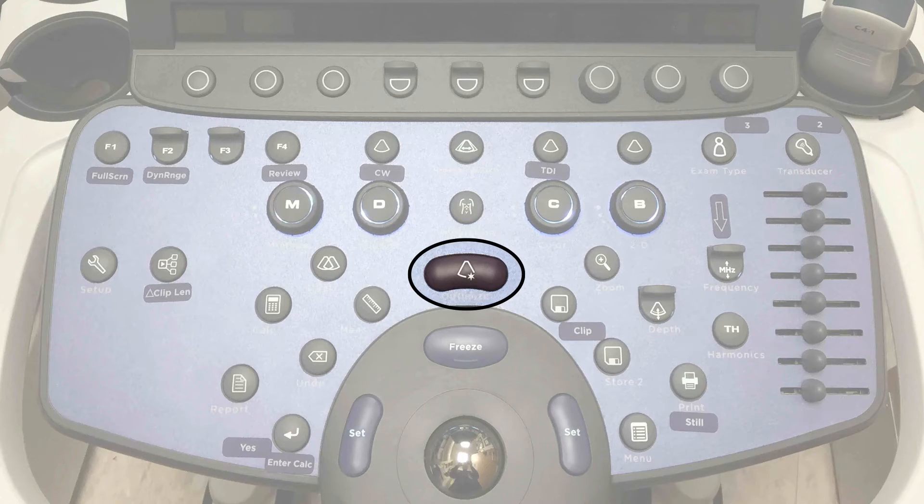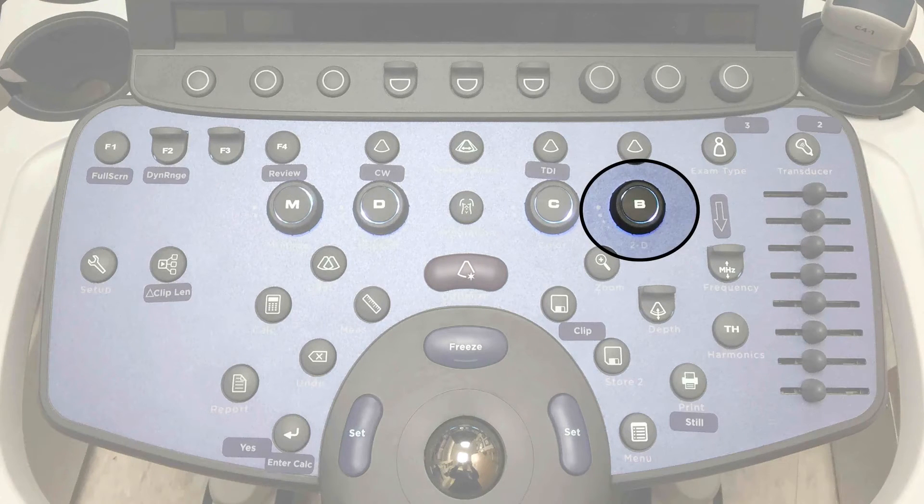When you're changing views or need to change gain, I suggest pressing optimize first, then doing cleanup and fine adjustment with the B mode dial. Each mode — in this case B mode — has a dial around its button. You can turn the dial to the right to increase gain or to the left to decrease gain.